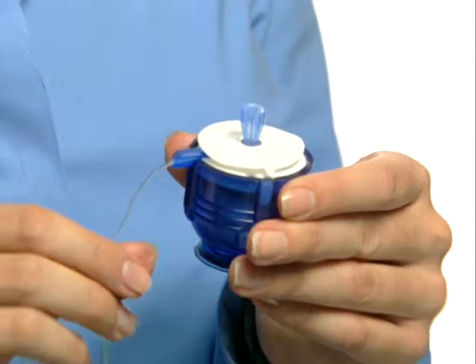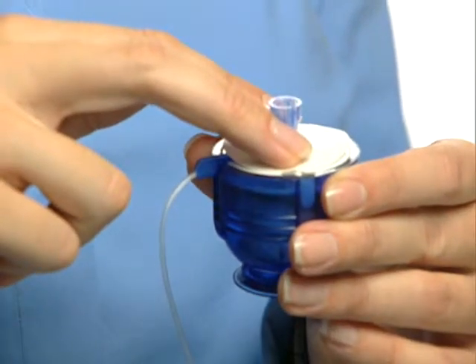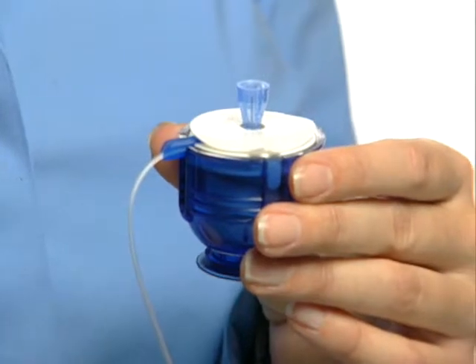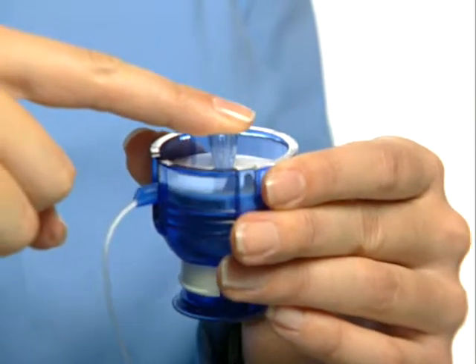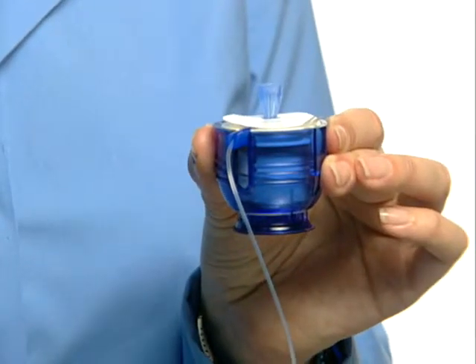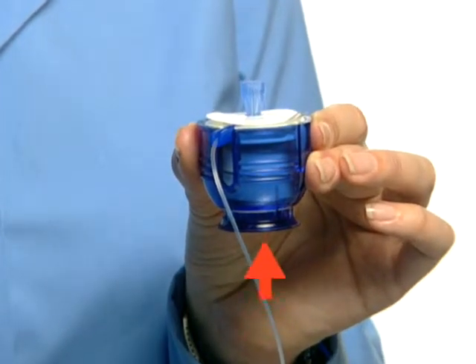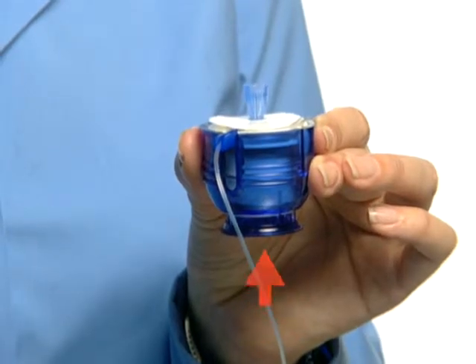Using your index and middle fingers, seat the infusion set within the serter by partially pressing the set into the serter while holding the barrel steady with your other hand. Another option is to press lightly on the needle guard with your index finger to seat the infusion set in the serter while holding the barrel steady with your other hand. Do not push against the button at the end of the serter, as this is used to release the set.